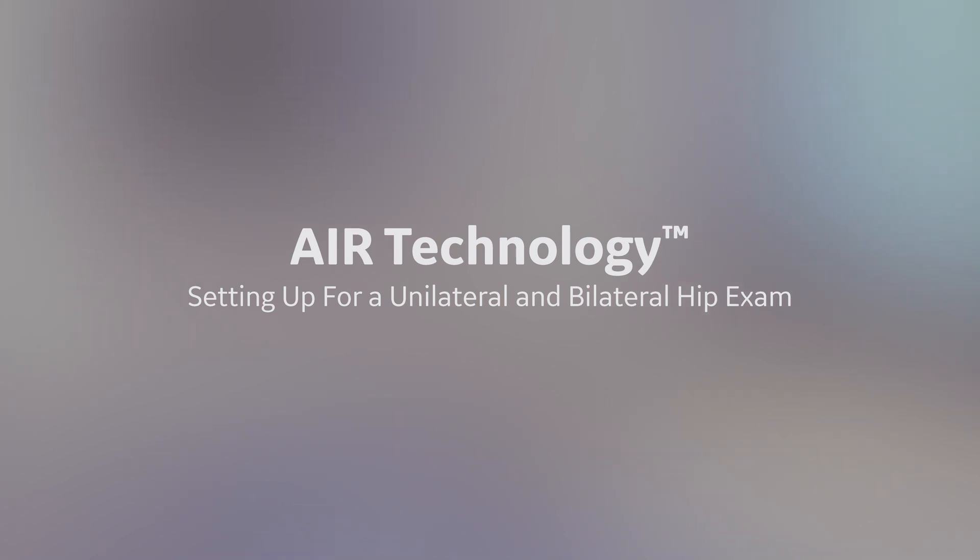Let's see how we can use the Air Technology Anterior Ray Coil to set up for both a unilateral and a bilateral hip.